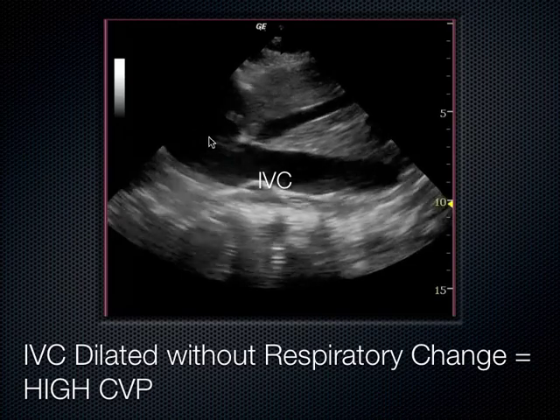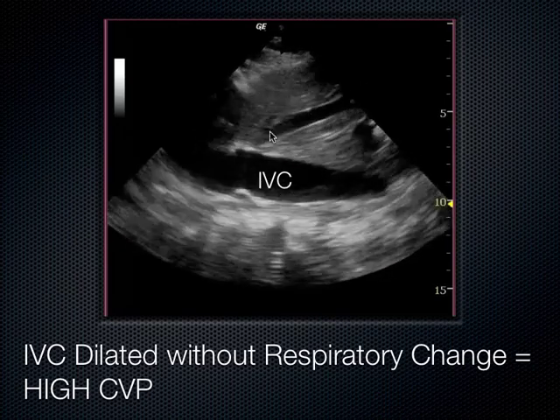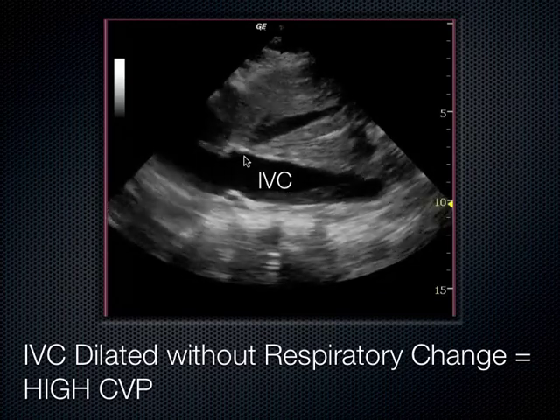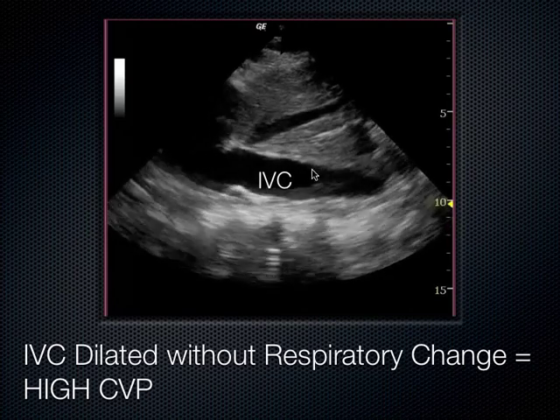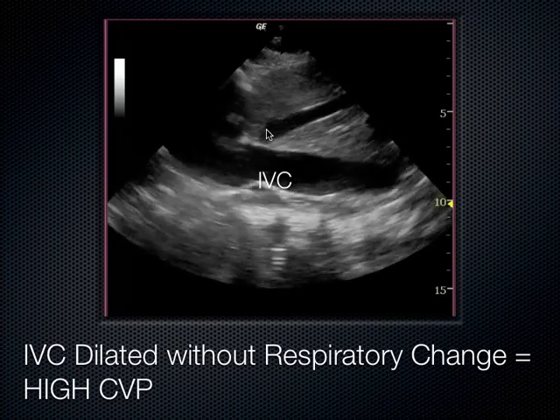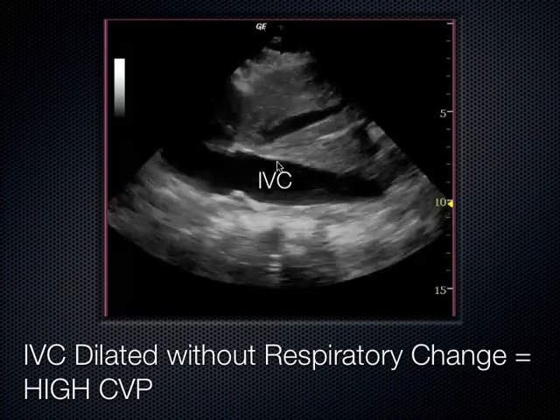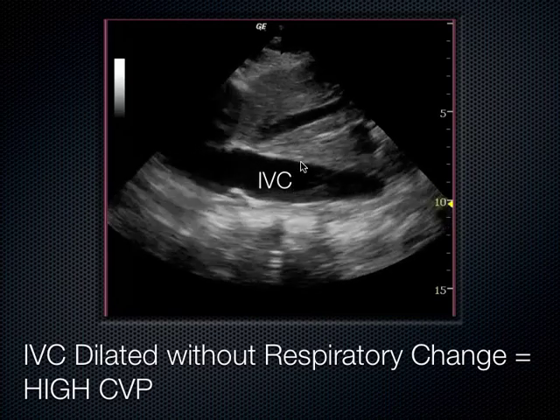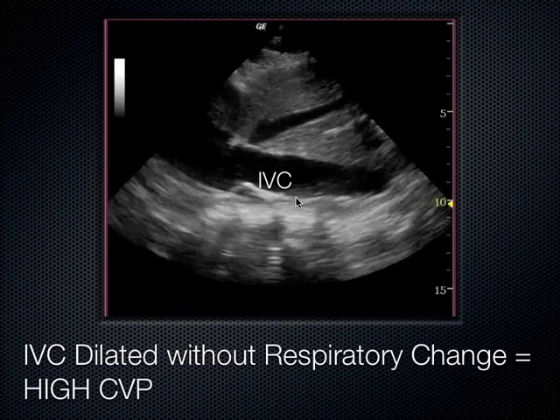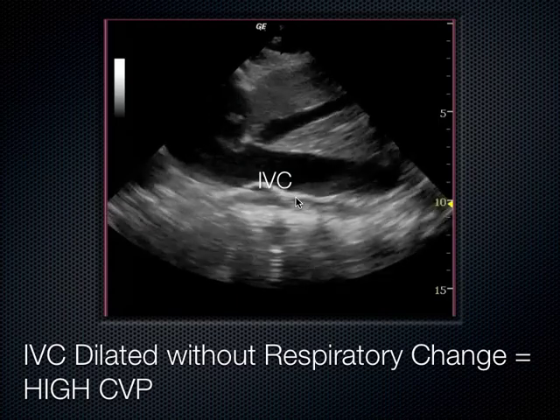This is the heart right here. This is the right atrium of the heart. Here's the IVC coming across the screen underneath the liver. This is the hepatic vein right here. People always say, well, where do I measure the IVC? Over here, over here, over here. It's a hotly debated topic. Probably 2 centimeters distal to where the hepatic vein dumps into the IVC, so maybe around here, is where most people agree to measure the IVC diameter. I'm just throwing this out there. It's going to come up over and over again. I want you to be aware of it and how powerful that can be.